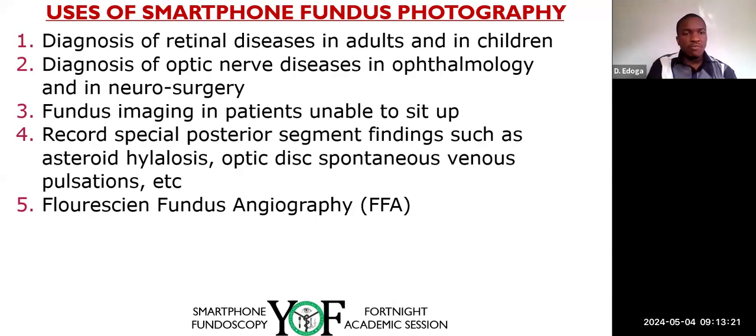Then with some filters, it has been used for fluorescent fundus photography. And lastly, it has also been used in teaching, both for medical students and also in teaching patients. I'll show you a video clip of where I was teaching a patient after taking the image of the retina.